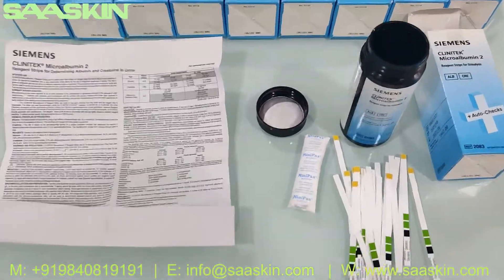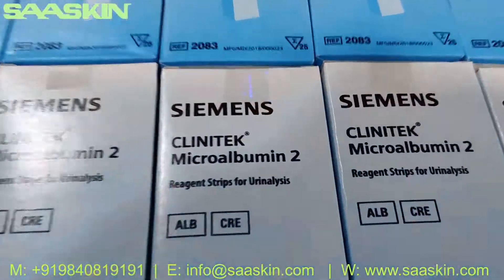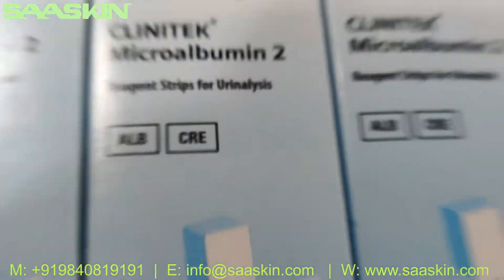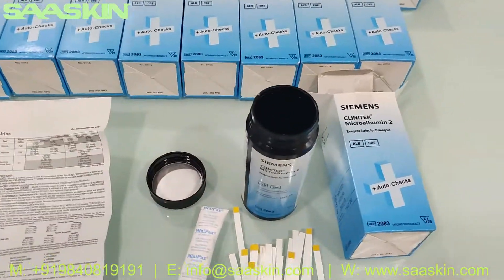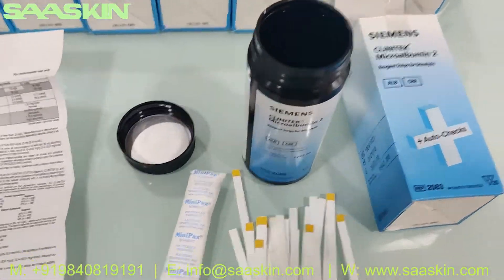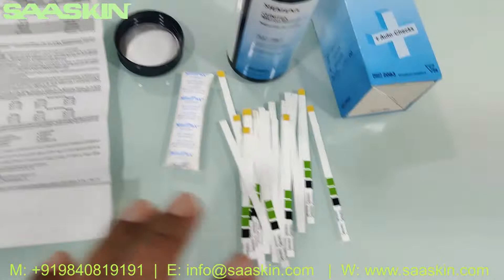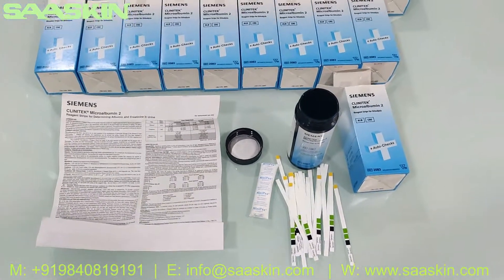To quickly summarize: this is the Siemens Clinitek microalbumin 2 reagent strips for urine analysis, which covers albumin and creatinine testing. It is a 25-test kit box, and each bottle contains 25 strips along with one IFU brochure. This is how the total kit looks like.